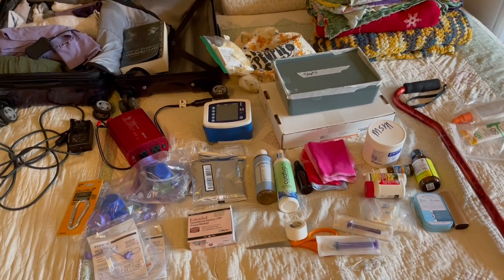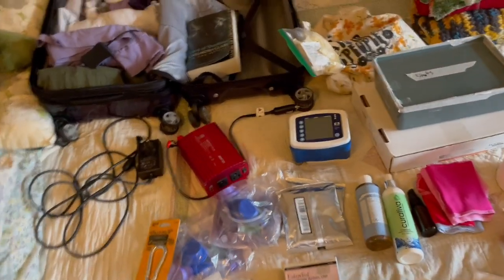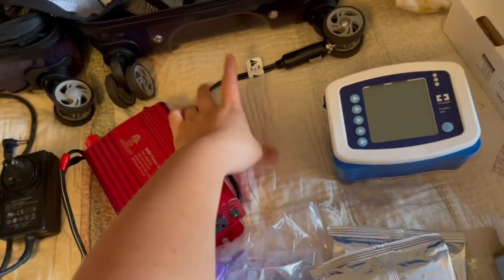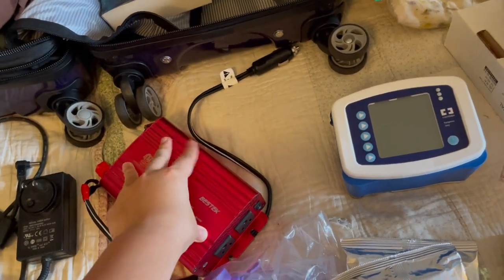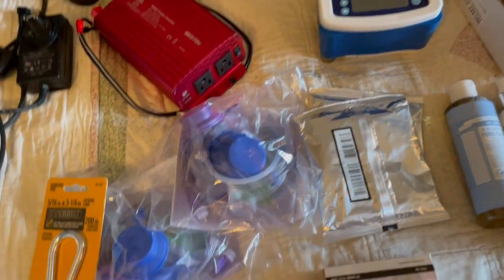I'll also bring you guys along for the camping part and show you the fun swimming times, the campsite, and all of that. Let's get into the video. So here we have all the supplies that I'm bringing with me. I'm going to start up here with my feeding tube pump — here's my pump and my charger. And this is my inverter: this plugs into the car outlet and turns into a regular wall outlet, so I'm able to leave the car running and charge my pump that way.